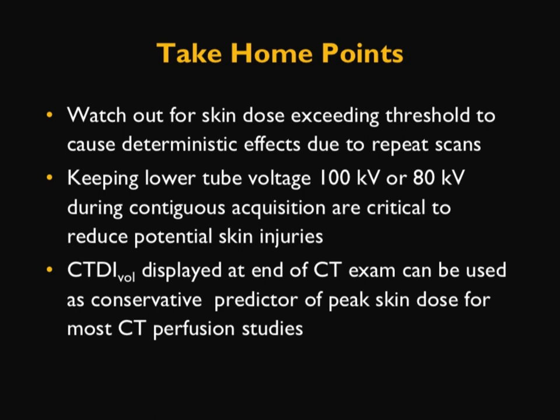Keeping a lower tube voltage of 100 kV or 80 kV during the contiguous acquisition is critical to reduce potential skin injury.